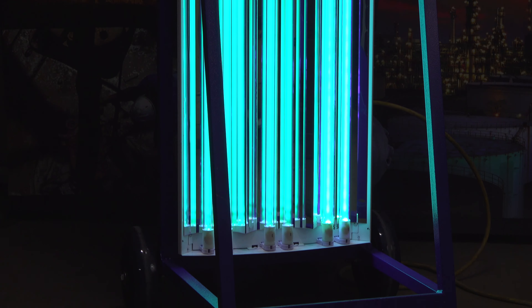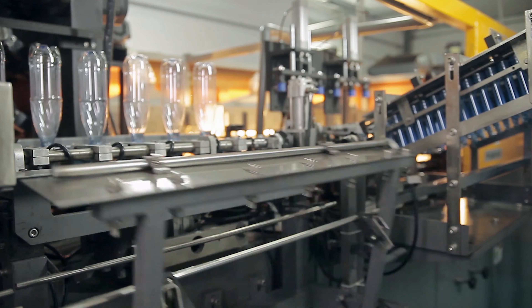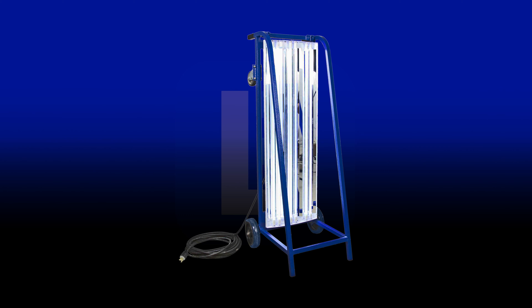Ultraviolet Sanitation Carts are an optimal way to disinfect and sanitize large industrial and commercial areas such as warehouses, manufacturing facilities, schools, office buildings, and medical facilities. Larson Electronics carries a wide variety of USA-made UV Sanitation Carts and devices for a variety of applications.